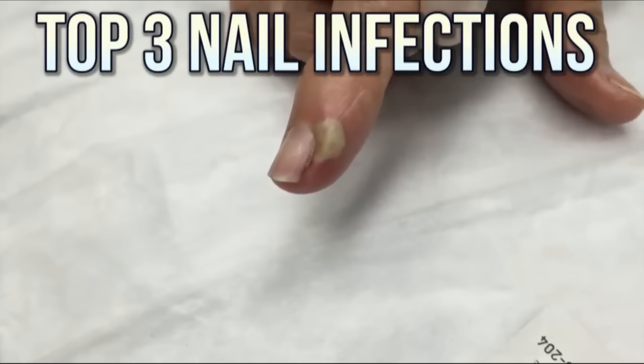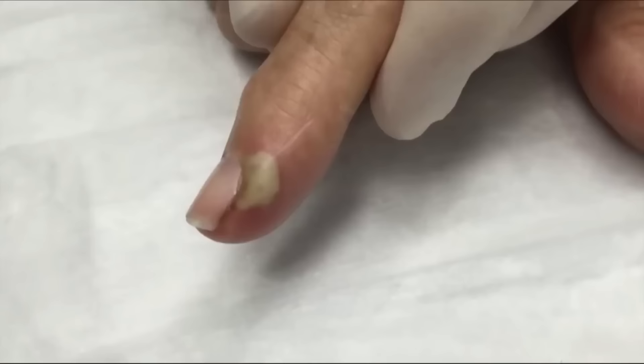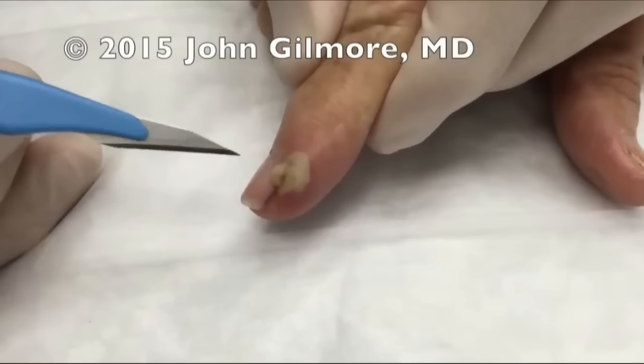All right, so what we're going to do is relieve this paronychia. You can see we have an infection on the side of the nail — it is not an ingrown nail. We're not going to use any lidocaine or anesthetic except for our cold spray. We're going to make a quick incision, just like that.